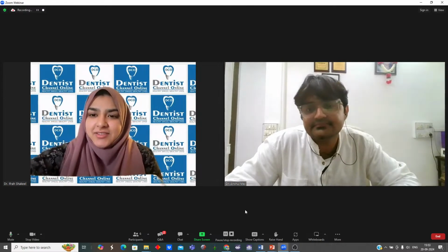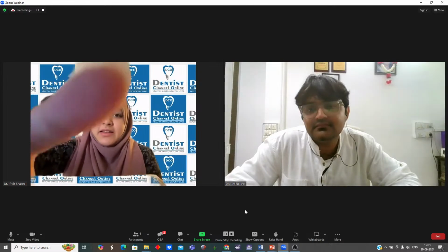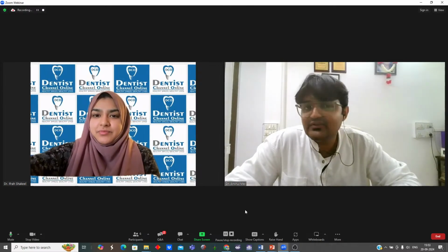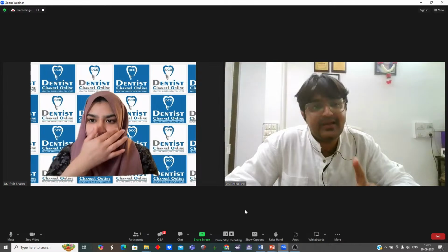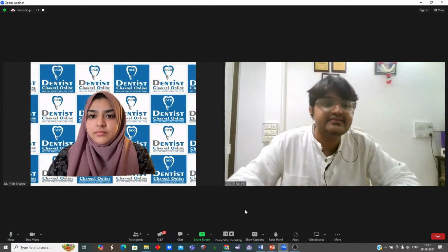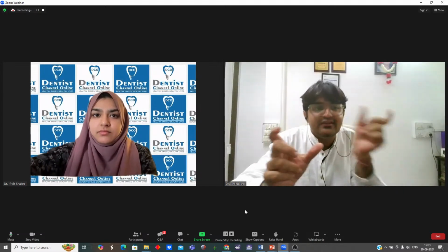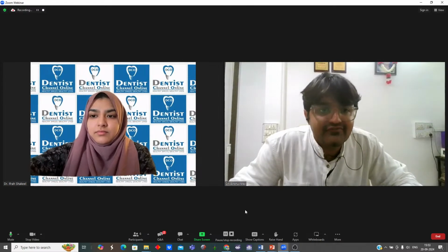All right, this is the thing. The next question is, which software can we use for smile designing, mockups and treatment planning? Yeah, see, one more thing I want to tell you. The software question you have asked is good, but in the market you have 2D smile design software and 3D software also. 2D just impresses the patient. You take a photograph, give them a smile, and just finish off the thing, the patient gets impressed and is ready for the smile design.